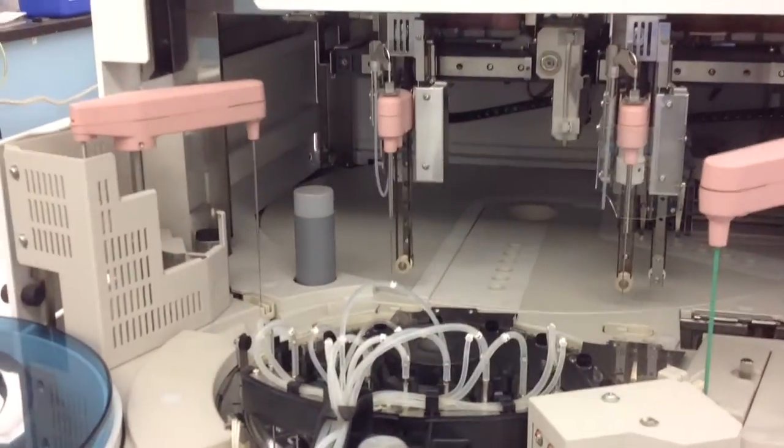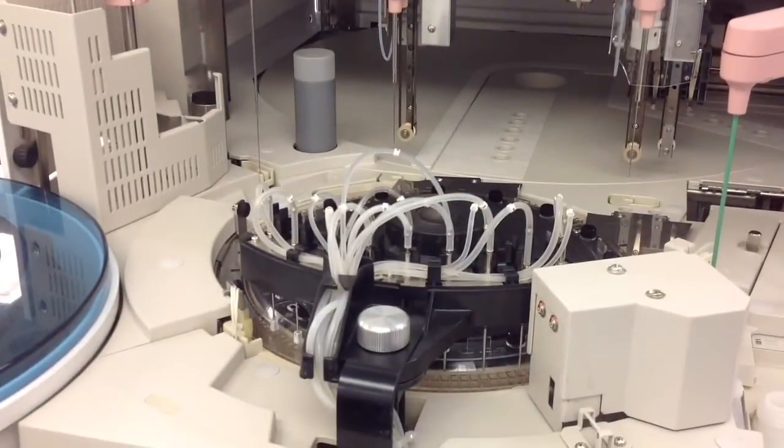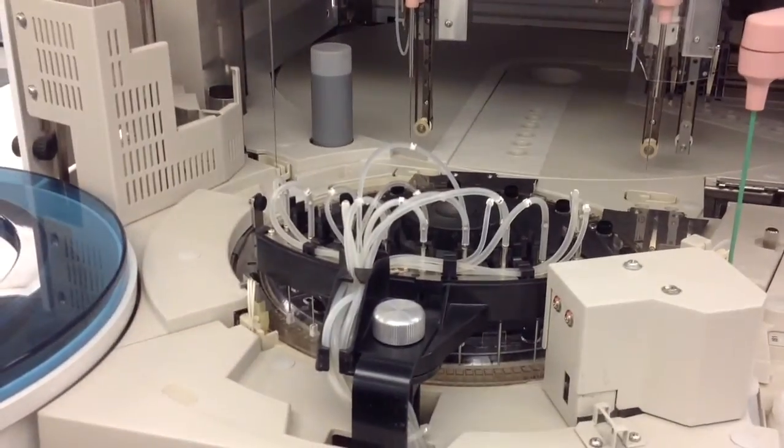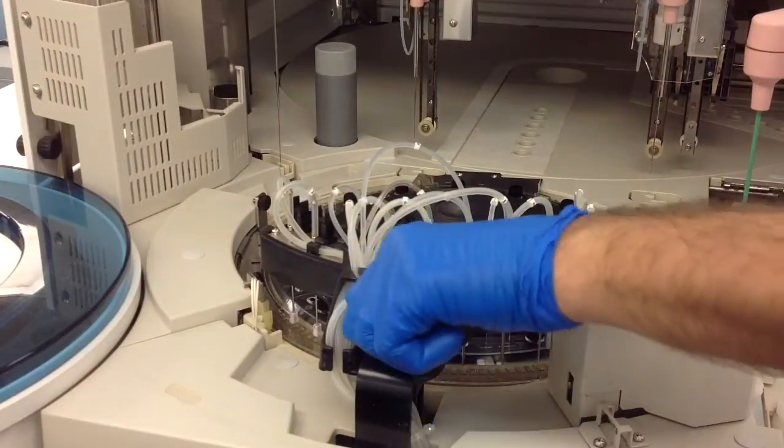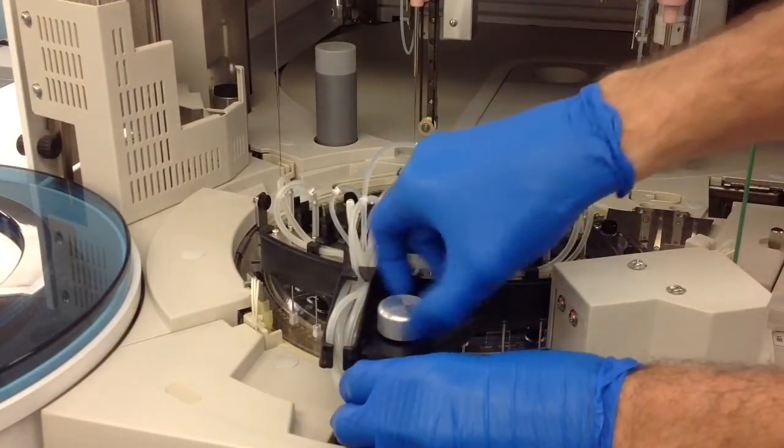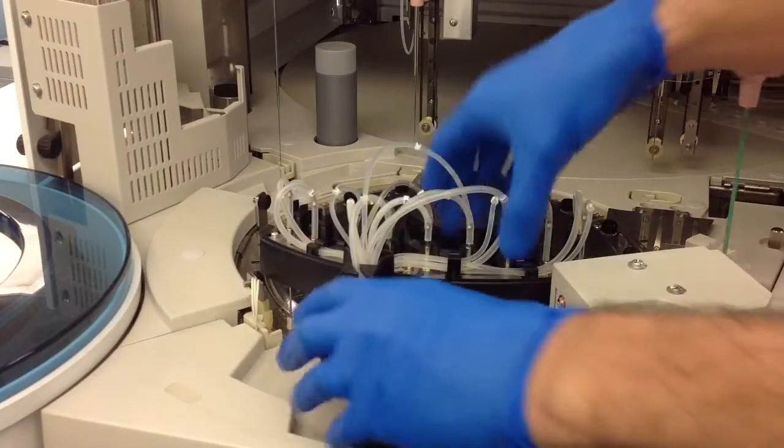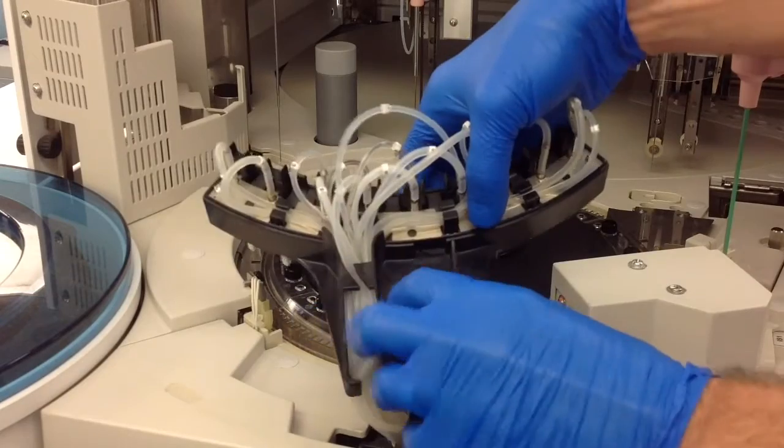After you've cleaned all the probes with alcohol, the next step is to go ahead and worry about the reaction cell cleaning station and you have to go ahead and unscrew that. You don't really have to do this, you could just try and clean it without undoing it, but just so you can see it better I decided to undo it.